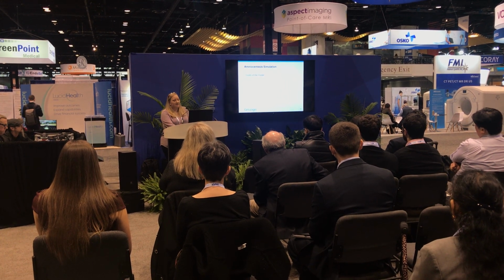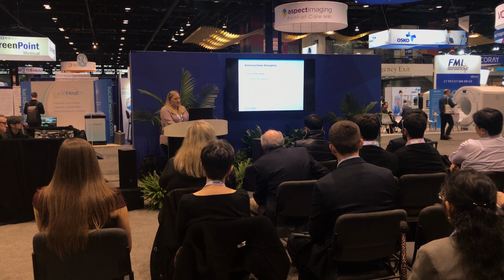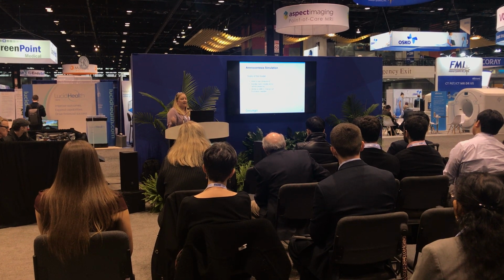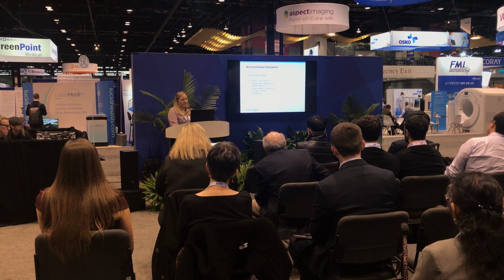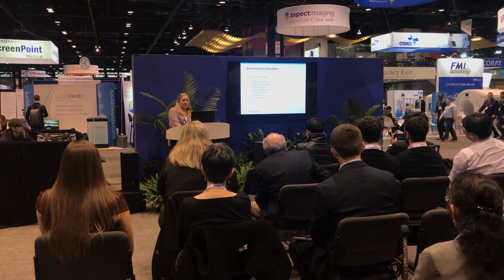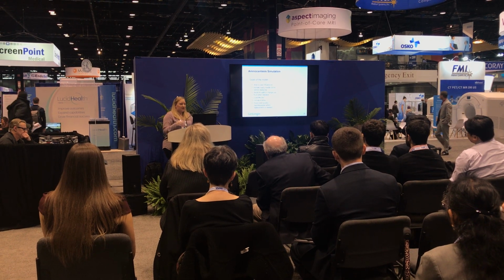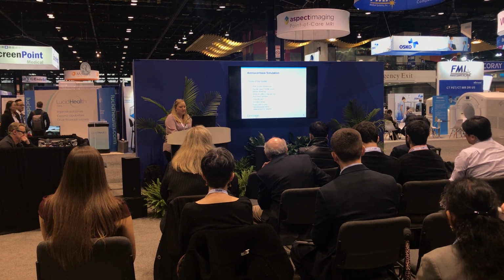For this amniocentesis simulation model, there were a decent amount of goals, but one was the ability to use ultrasound. It has to handle multiple needle sticks. We can't just have this as a one-off. It needs the ability to refill or change out fluid, and make it a little more viscous if they need. Obviously, it has to look a little bit lifelike, and they wanted it to include a fetus. And if it does start to leak, I need to be able to get them another one within a day, so let's make sure it's easily reproducible.